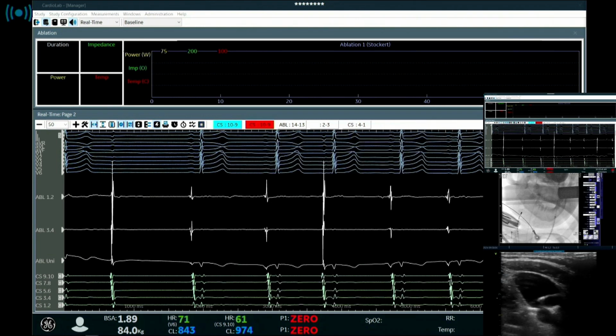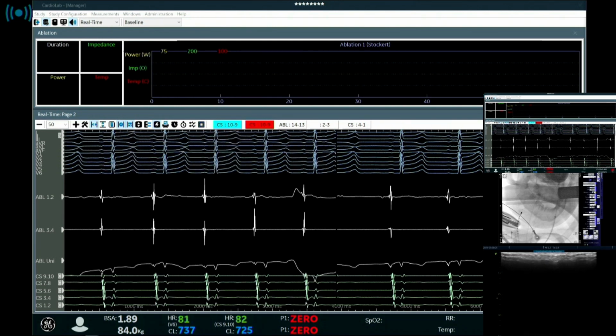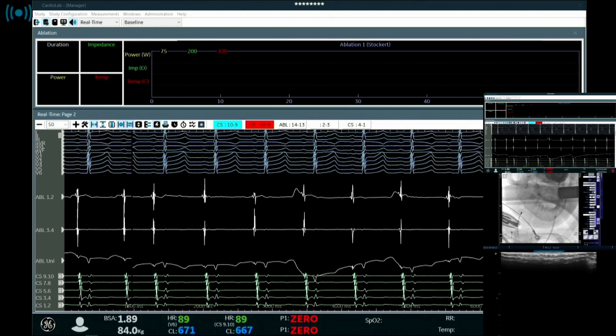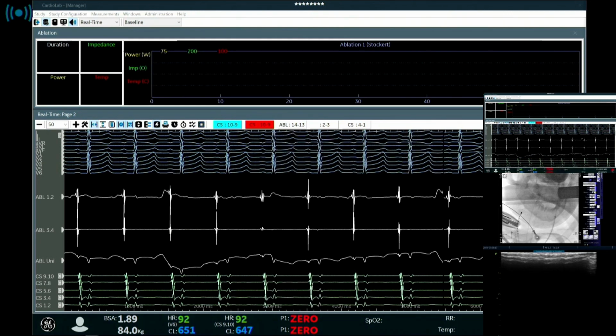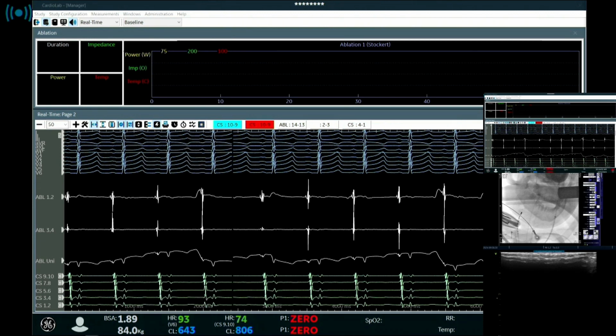Nice. So can we change ultrasound to the eyes? So Predrag does everything I want. So I think from my side it's just burn.